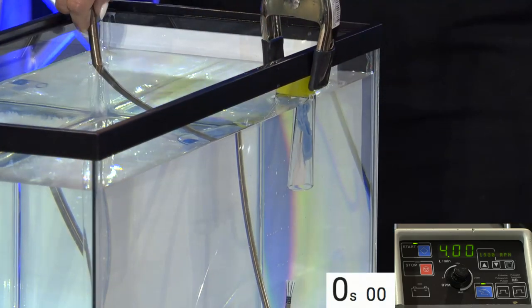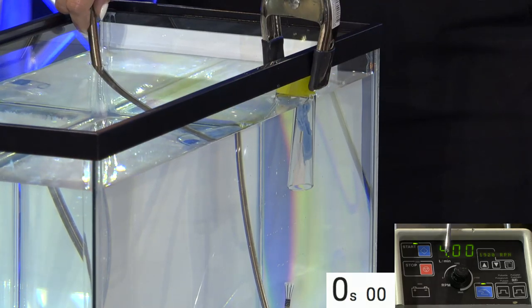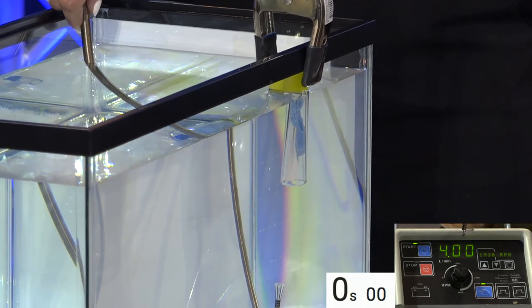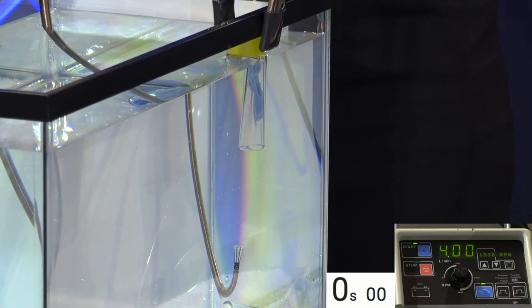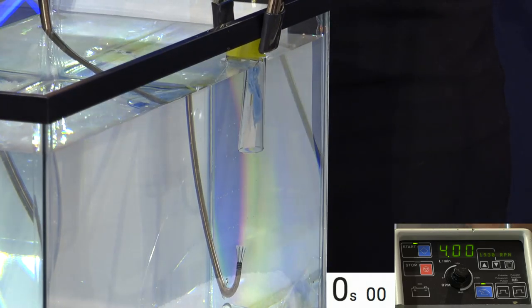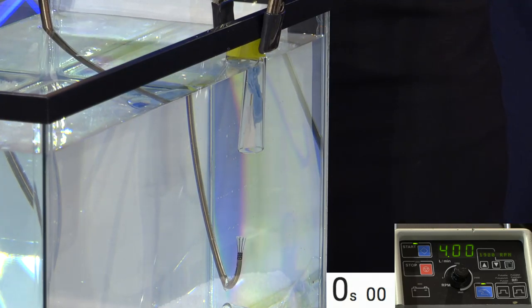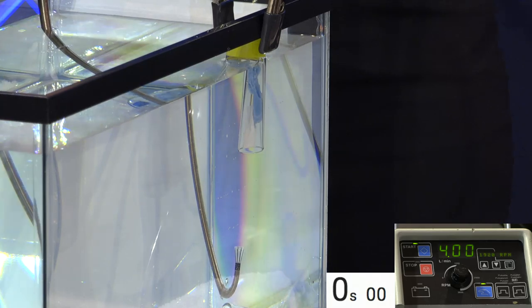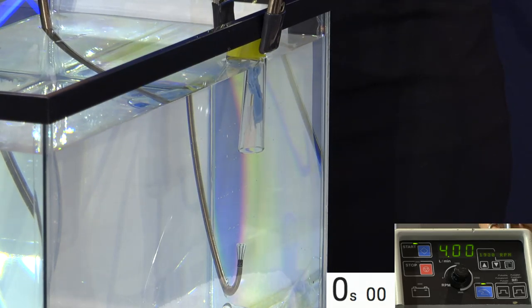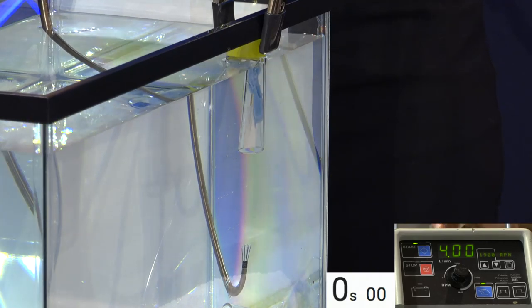Thank you. Perfect. Okay. Now, with that said, you're going to see the flow go to zero. She's going to say engaged. I'm going to say engaged. The clock is going to start because we're not going to have any more flow for a brief period of time, right? And make sure you tell them do not turn the flow down when that happens. Whatever you do, that's what you want to have happen. But again, the patient will be without circulation. The clock starts.